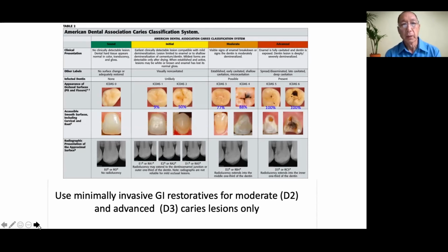The second row of pictures are the facial and lingual. Same thing there. Green, yellow, orange column can all be treated with what Ian already described as surface protection, or simply remineralization using CAMBRA, or silver diamine fluoride. The bottom row is where it's problematic, because people read radiographs thinking they're looking at cavitation, when in fact it's just picking up mineral density, usually meaning the extent of demineralization.